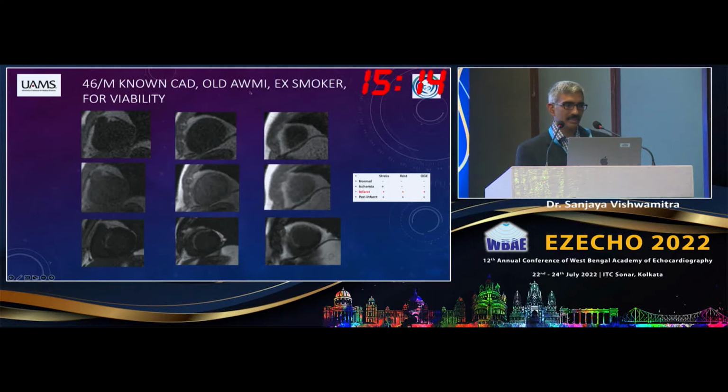This is the third concept. So I've shown you a normal myocardium, I've shown you ischemia, and now just to show you what an infarcted myocardium would look like. Okay, let's see if I can get this to play. So essentially, if you look at the delayed enhancement views, you can see the LAD territory infarct as shown by the white area of delayed enhancement.